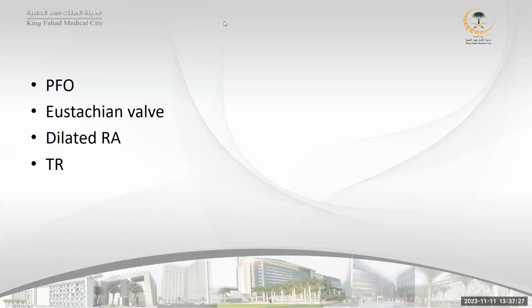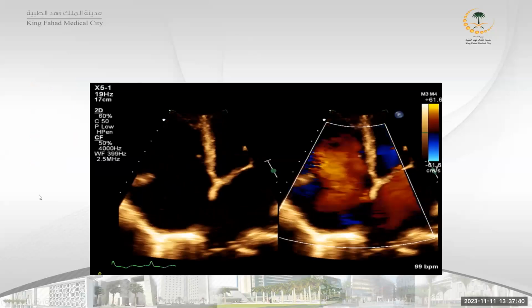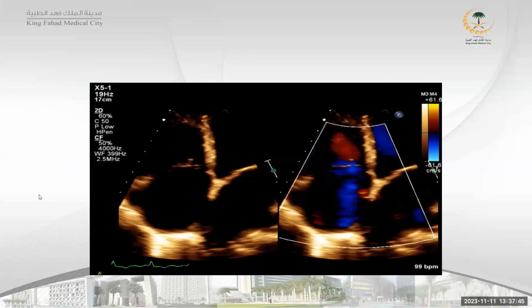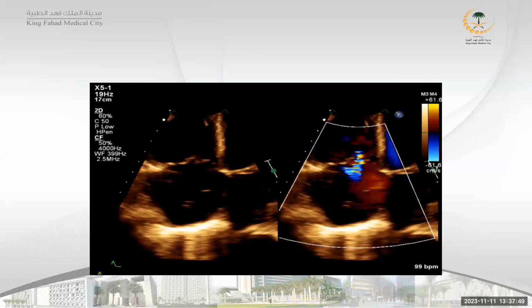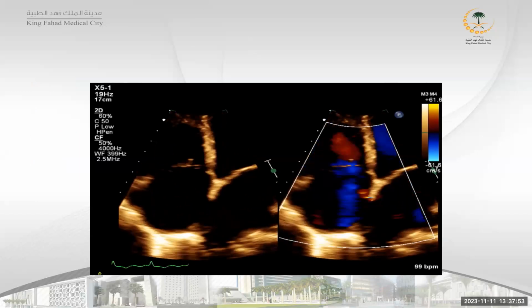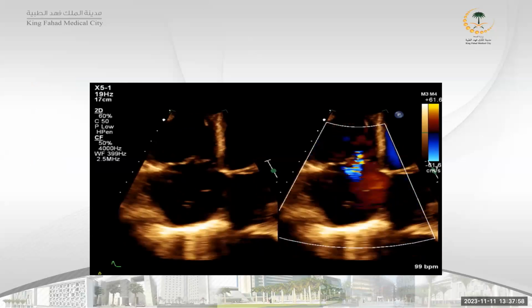I think there is something I have to comment. Somebody wrote apical displacement of the tricuspid valve. I think you cannot comment about apical displacement. That means you have a suspicion of Ebstein anomaly. And usually in this case, he should bring all the RV views for you because the main pathology is in the right ventricle, as you know. And we can come to that later.